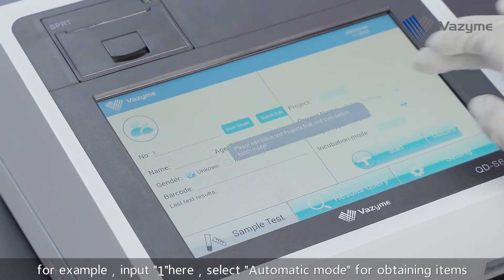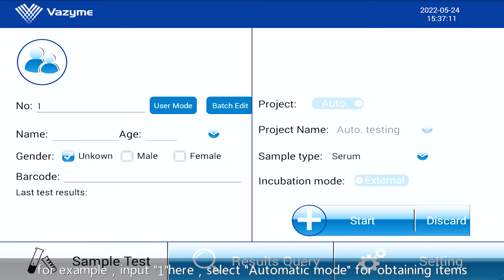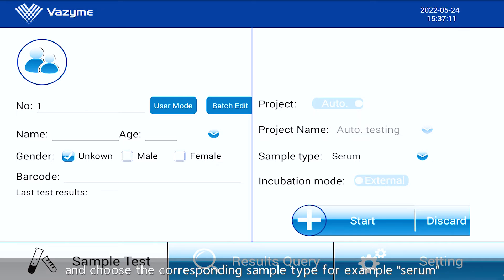Input the sample number — for example, input 1. Select Automatic Mode for obtaining items and choose the corresponding sample type, for example serum.